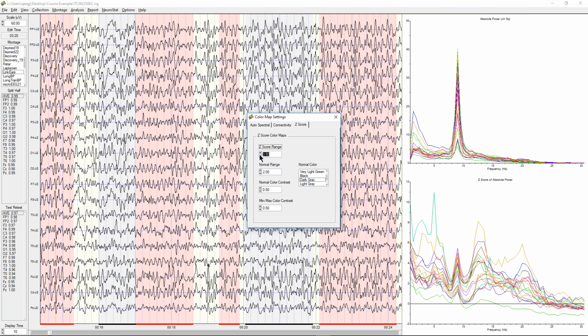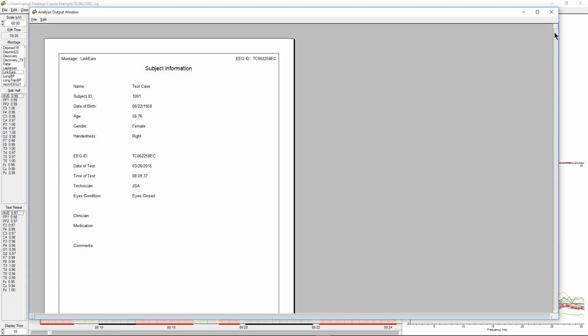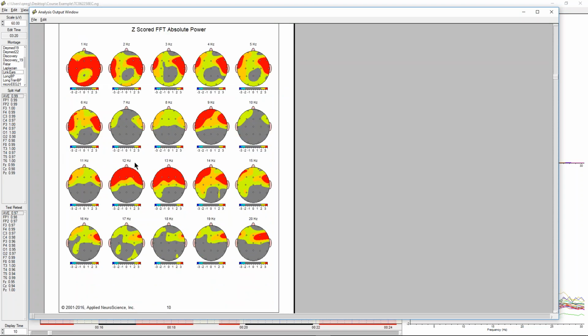I think what we'll do is go from 2 to 3.5. And we'll run those again. So this person has a lot of findings, and she certainly has the history to go with it of a right-sided but somewhat frontal impact injury.